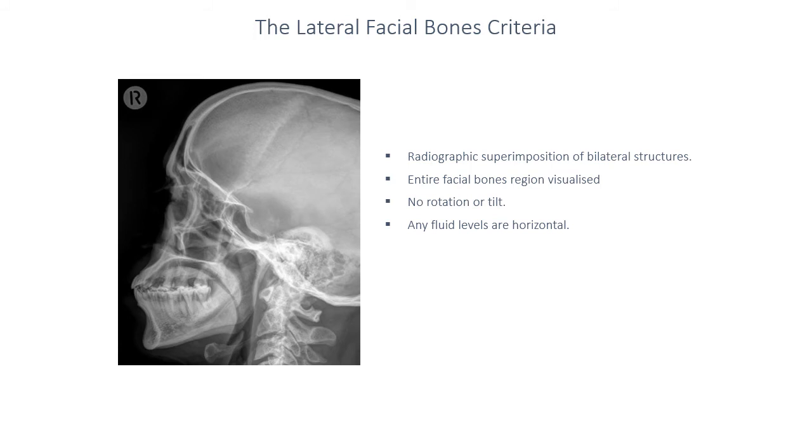If the patient has any fluid levels within their maxillary sinuses, they should be shown as a horizontal structure, that is, you're shooting across that fluid level.